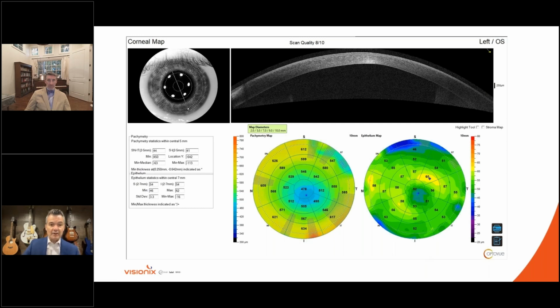Now, this is where the technology just starts to get kind of interesting, because this is where we do one of two things. It helps us in the diagnosis, and it also helps us in monitoring these patients over time. Jeff, how are you utilizing these scans in your practice, not only in terms of identifying the disease, but also monitoring it over time?